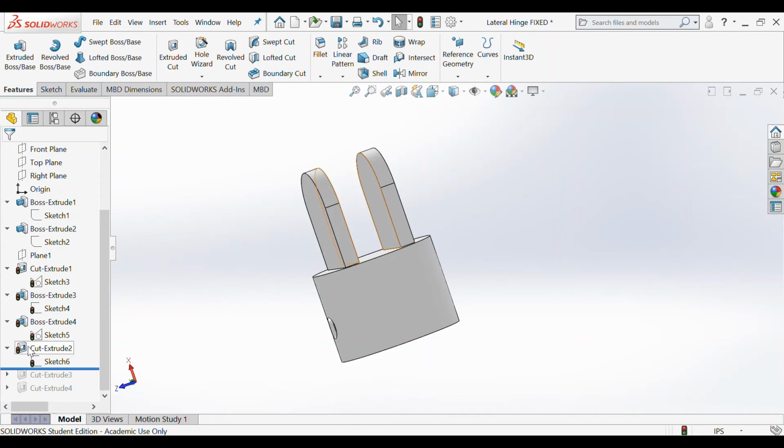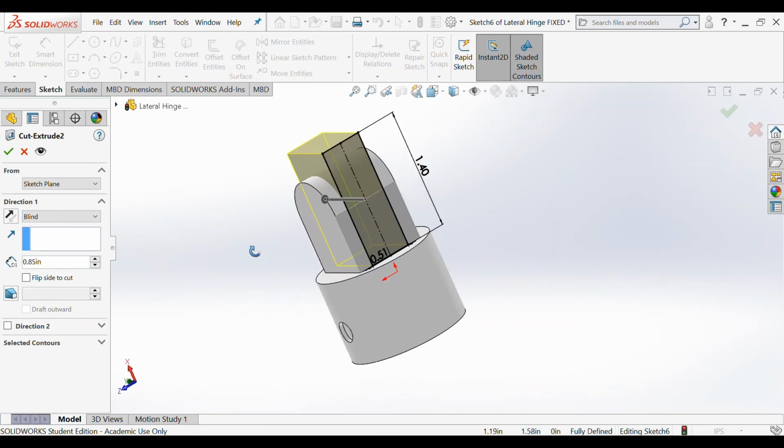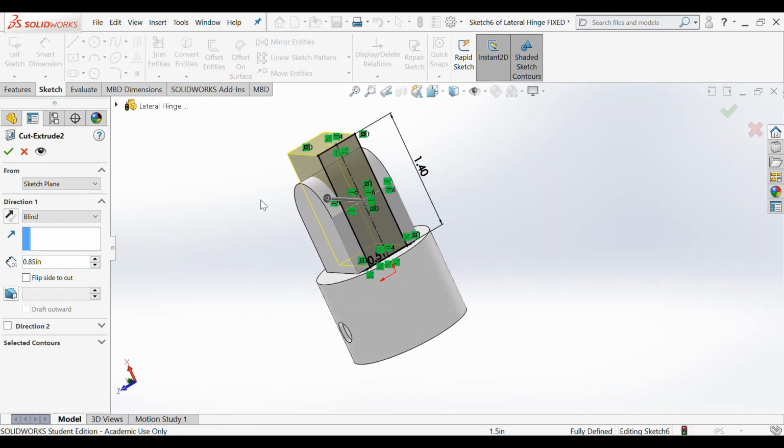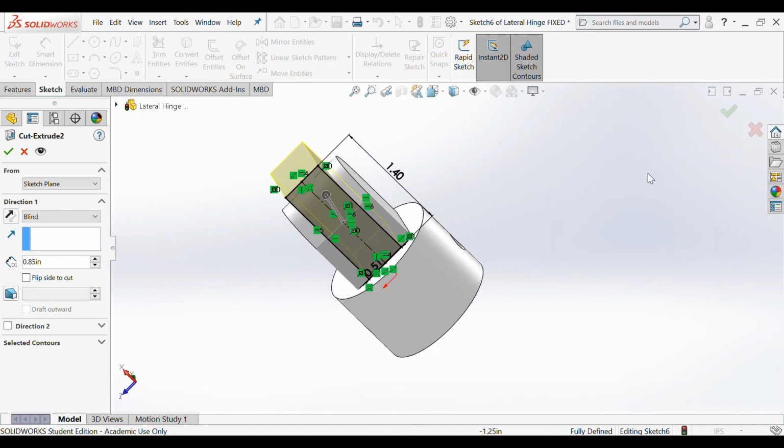We then cut extruded that sketch blindly all the way through at 0.85 inches in order to create these two pieces right here, and this allows space for the lateral connector piece to be inserted at a later time.